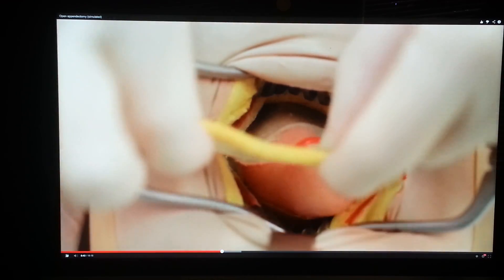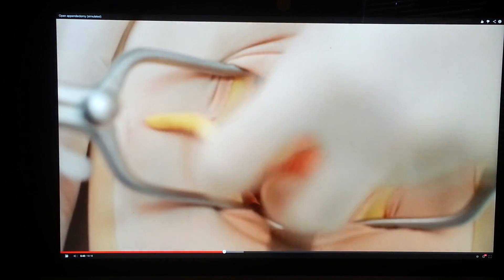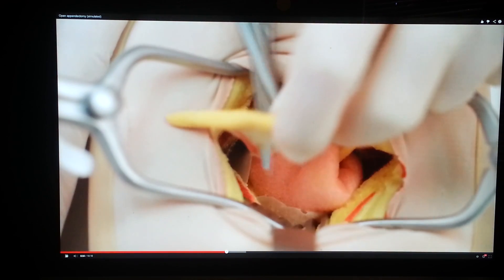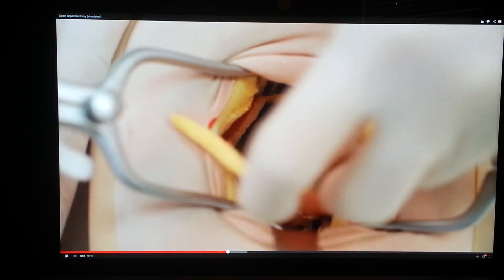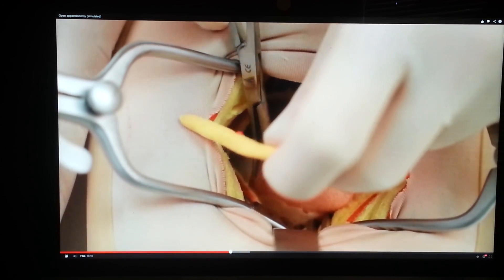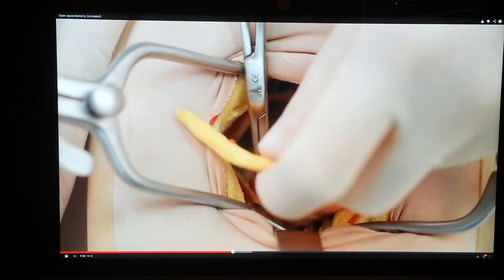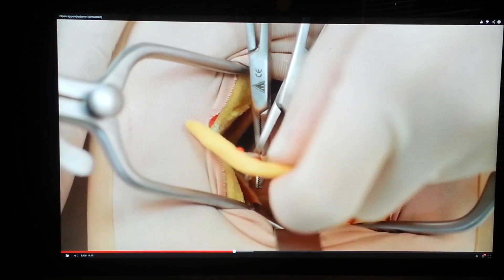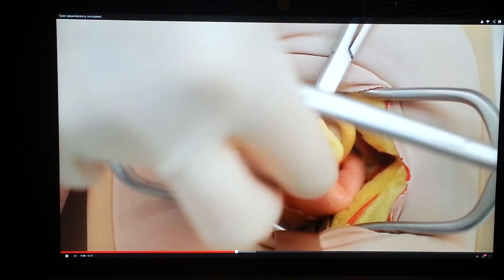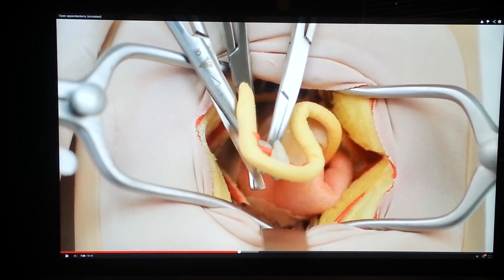View the mesoappendix against the light to identify the appendicular artery, which enters from the medial aspect. Create a window in the mesoappendix avoiding the vessels and ligate the vessels between clips using two Vicryl sutures. Divide the vessels and then divide the mesoappendix.